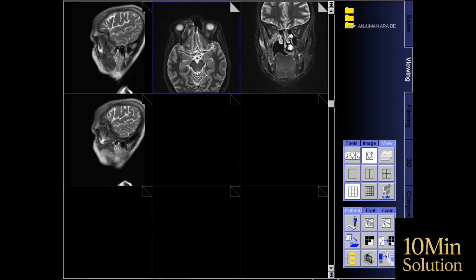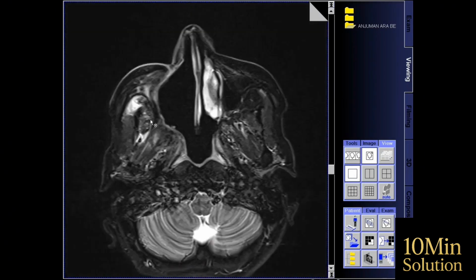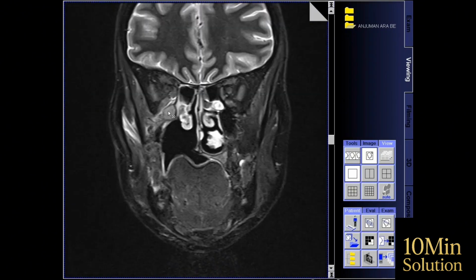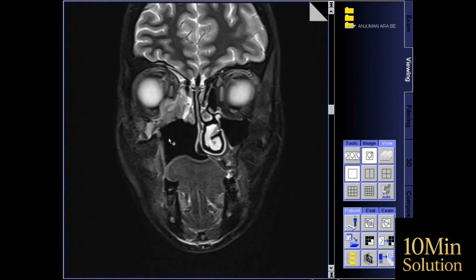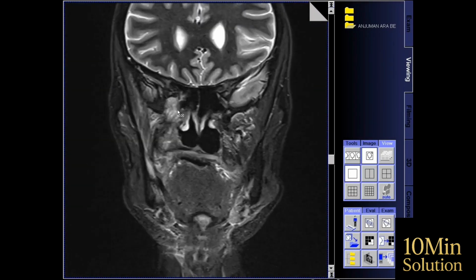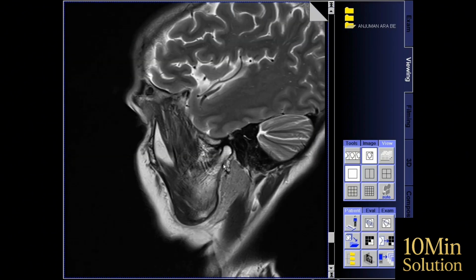If I show you the images, you'll understand that on the right side here, we can clearly see that this patient definitely needs to be given contrast. In the coronal, we can see right here, in this specific area, where the contrast is required. See, it's coming out very nicely, and this is the sagittal plane. This is how we've planned it.